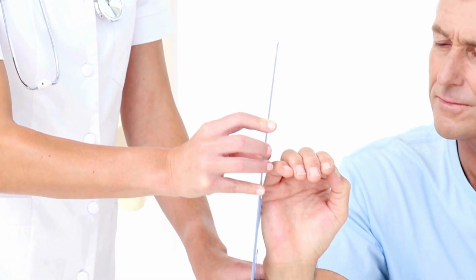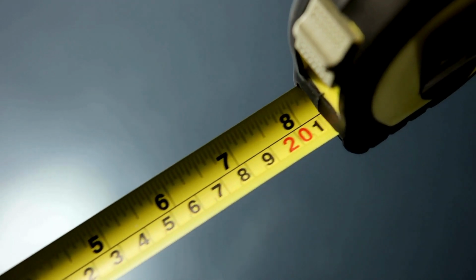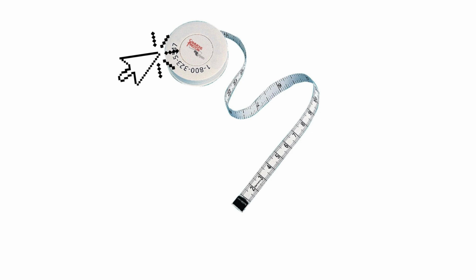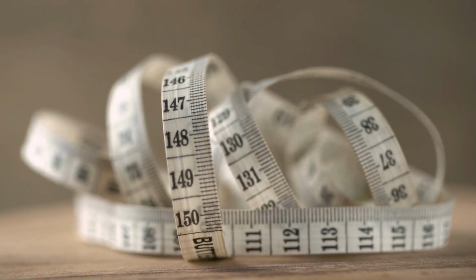pre- and post-intervention outcomes. So, what about the measuring tape? Can we just use a normal one? In clinical assessments, it is important to use a non-stretchable and flexible measuring tape.